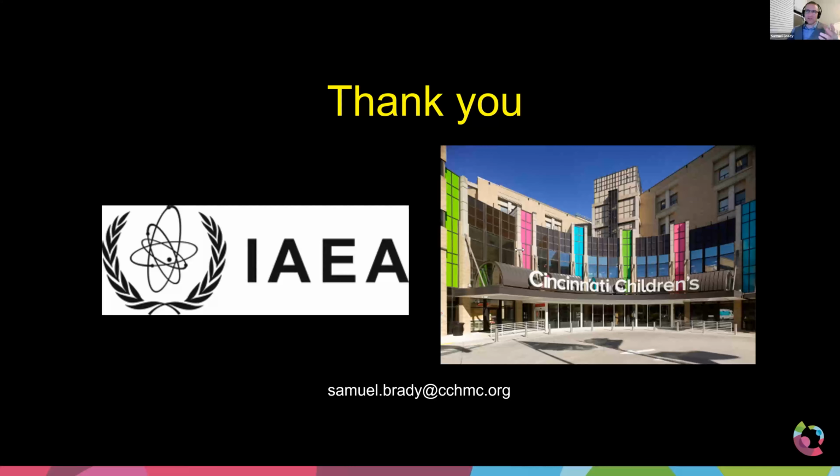3 millimeter if you've got a smaller patient. Our little kids, we do everything consistently at 3 millimeters. But oftentimes we will do a 5 millimeter, and then we'll also let the radiologist look at the 0.5 millimeters. Now the 0.5 millimeter images are really grainy, really noisy compared to the 5 millimeters. But if they're going through their fives and they think there's something in between these two images I want to see, they need to see something thinner. And so we have those for them to look at.